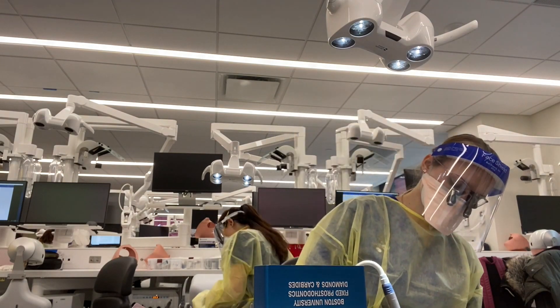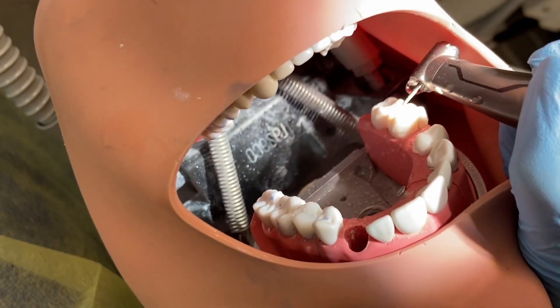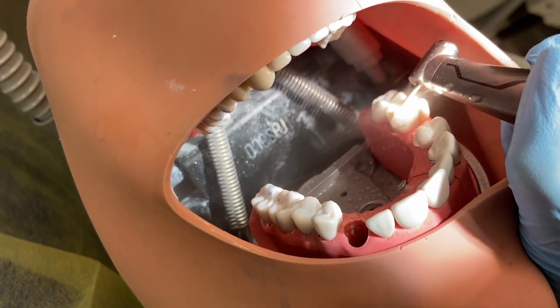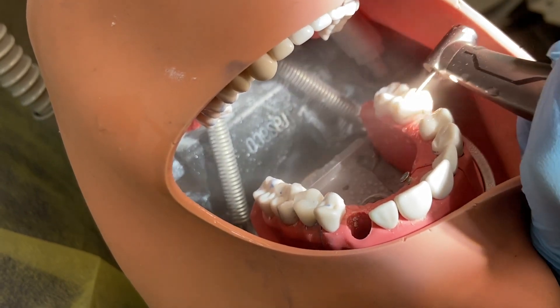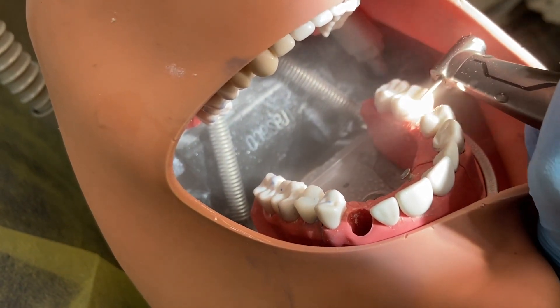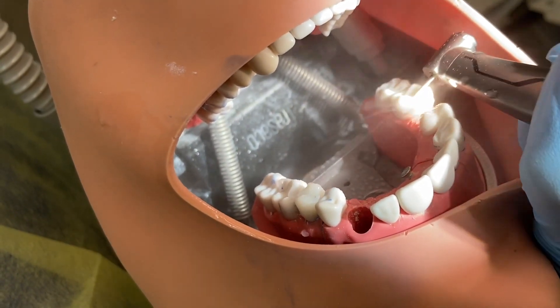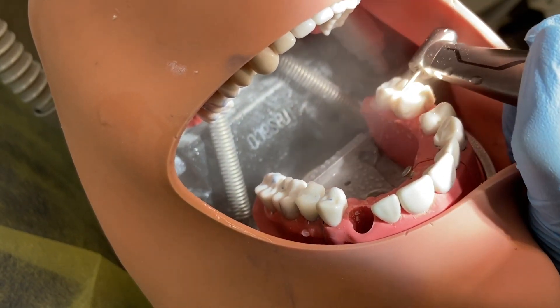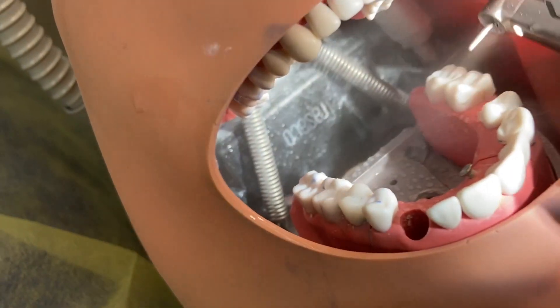The professors were all very supporting and understanding, and after the grading exercise was over we're allowed to practice as much as we can for our exam. Here is me trying to film my prep — prepping the teeth. The exam is going to be on the bridge on teeth 16 and 14: tooth 16 is going to be prepped for a full gold crown and tooth 14 is for a PFM. In American numbering that's obviously three and five — I'm still not used to the numbering system.